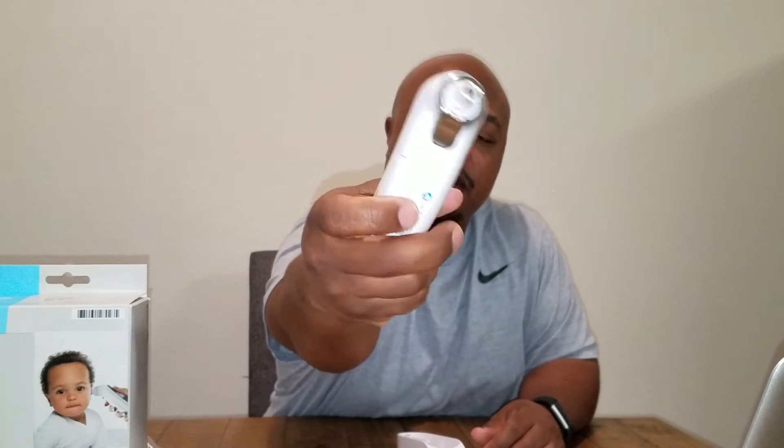So I was able to get it out the box — check it out, see what it do. It comes with the meter itself, you can see it there. Came with two batteries, which I already put in, and a storage case, so you just slide it in there, put it up, put it in the cabinet or whatever. Comes with a manual — y'all need to start reading the manual. And a probe filter. These right here you're going to replace after each use — that's your hygiene. You stick it in your ear, you don't want to stick it in somebody else's ear. So that's just going to go in there like that, and you'll pop it on there.